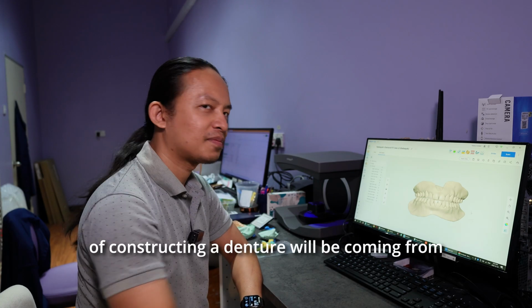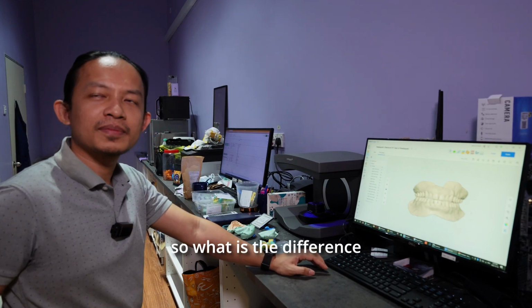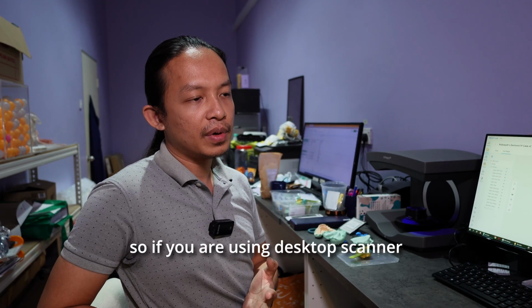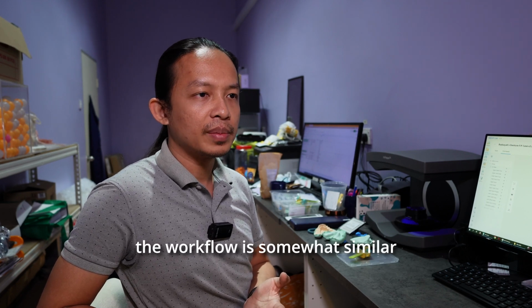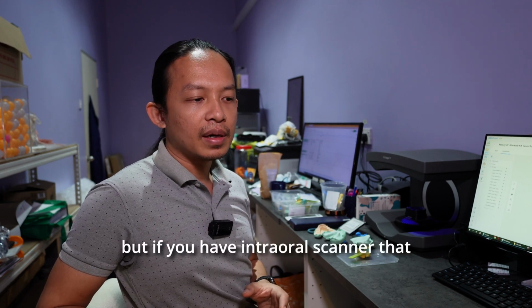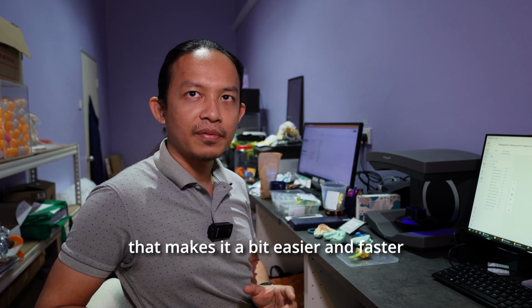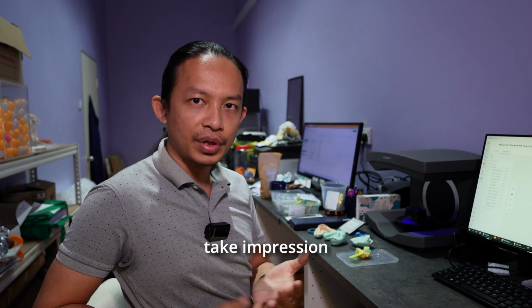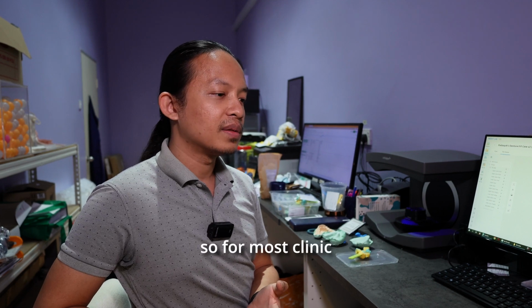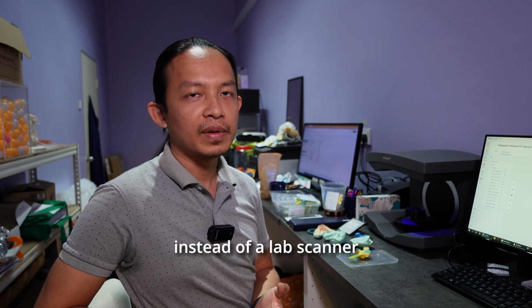The first step of constructing a denture will be taking the impression. So what is the difference between a digital workflow as well as an analog workflow? If you are using a desktop scanner, the workflow is somewhat similar to the conventional part, especially during the scanning and the impression taking. But if you have an intraoral scanner, that makes it a bit easier and faster because you don't need to take an impression, you don't need to pour the model, and then scan it again. All right. So for most clinics, usually an IOS is actually better instead of a lab scanner.